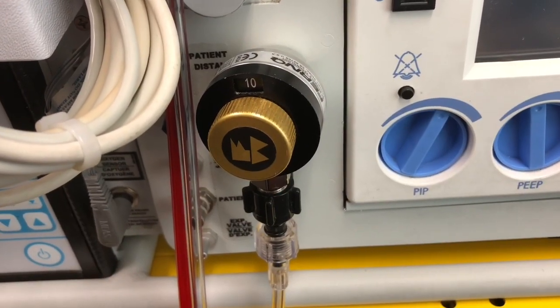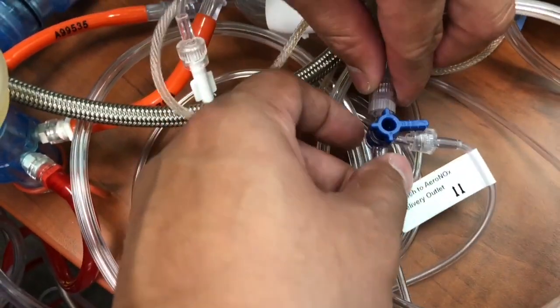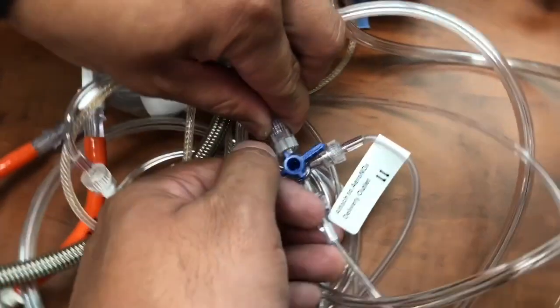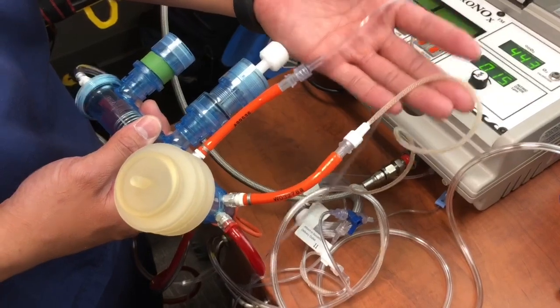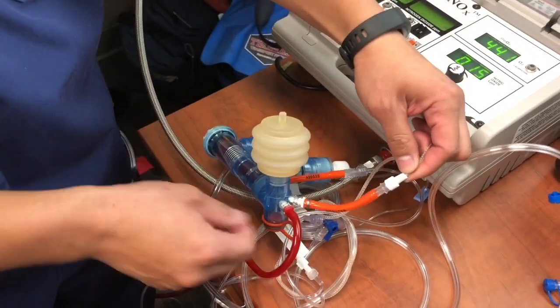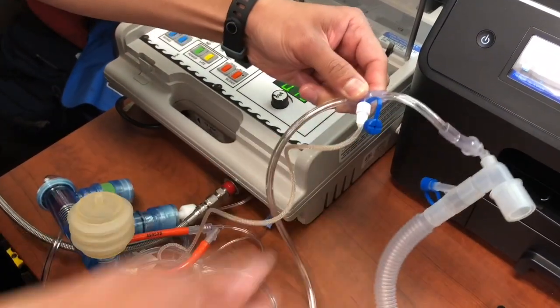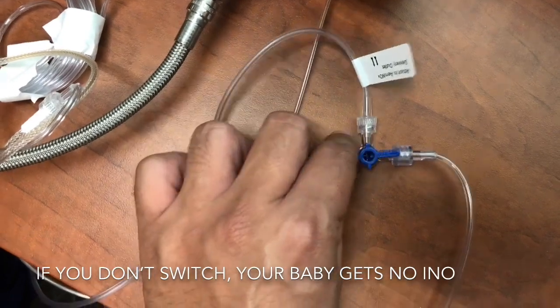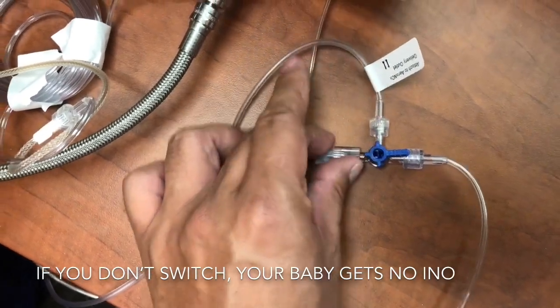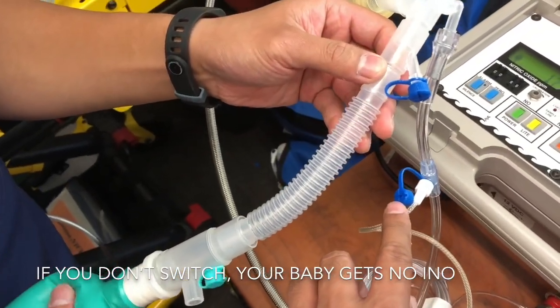If you have the bag set at 10 liters per minute, you're going to go to your delivery T, turn off to the patient so that the nitric is going to your Ambu bag. You're going to disconnect your sampling line — the white part — and hook it up to your bagger. Switch off to the patient and onto the bagger so the nitric is being delivered here, going up through into the bagger, and you're sampling right here before the patient.